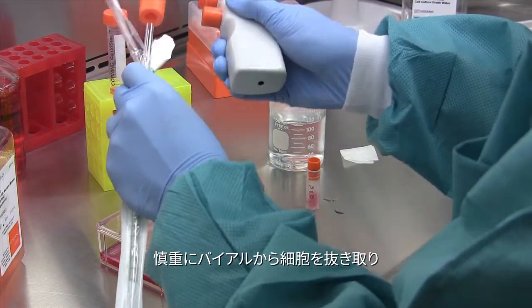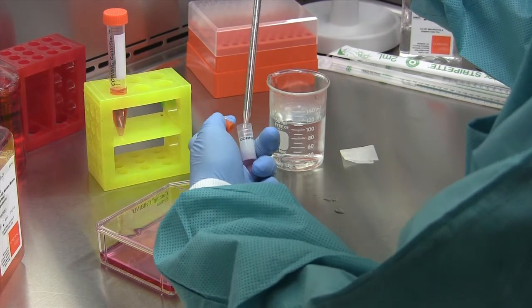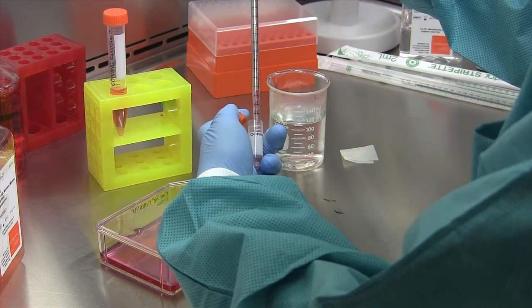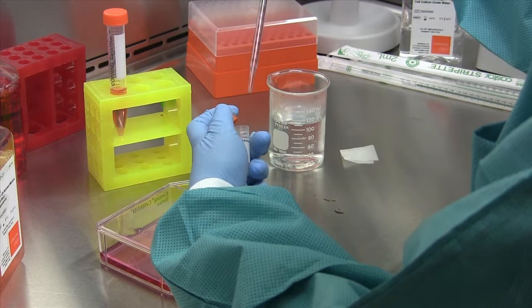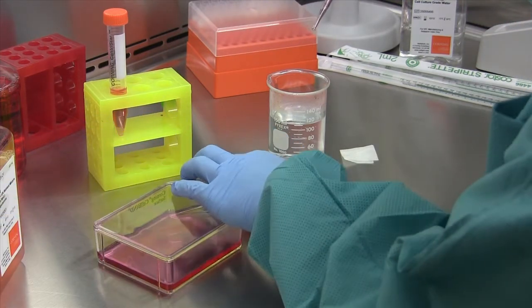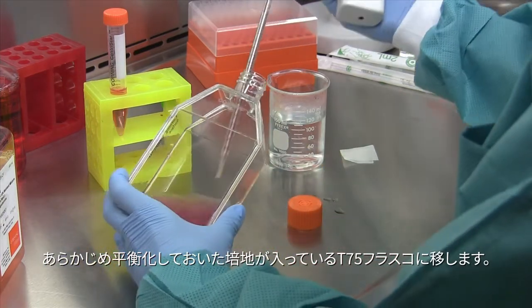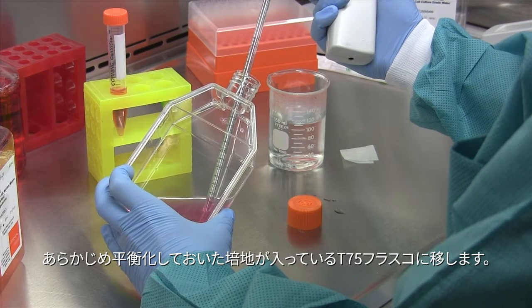You will then want to carefully remove the cells from the cryovial and transfer the cells to a T75 flask containing your pre-equilibrated media.